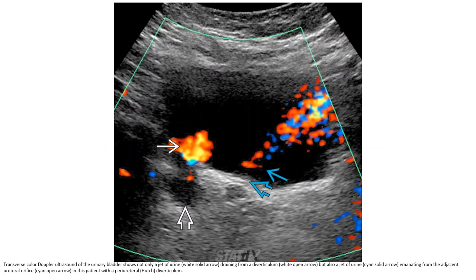This is a color Doppler ultrasound of a urinary bladder, showing not only a jet of urine emanating from a diverticulum, but also a jet of urine emanating from the adjacent ureteral orifice in this patient with periureteral diverticulum.